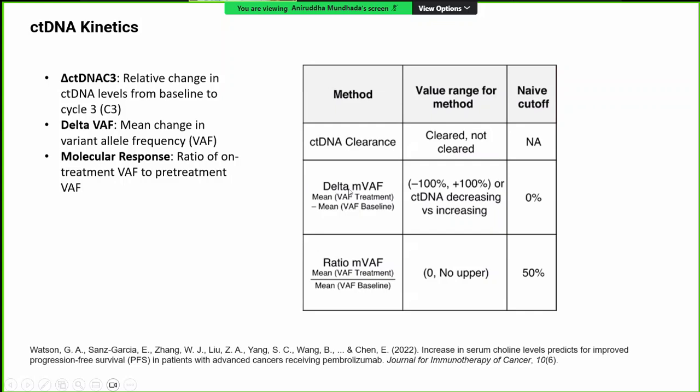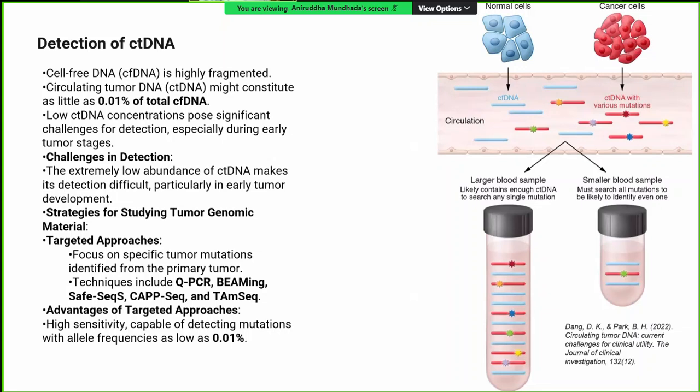In molecular response, there is a ratio of on-treatment VAF to pre-treatment VAF, and this can also be studied, where the ratio defines the treatment response.